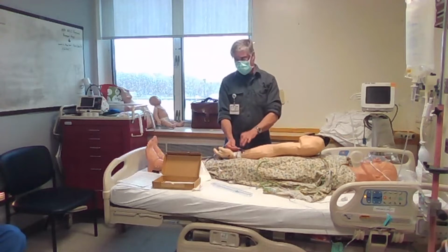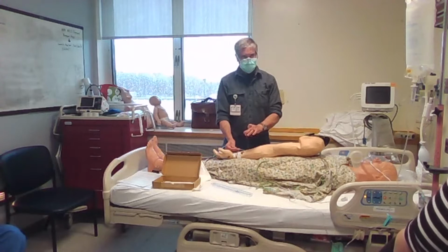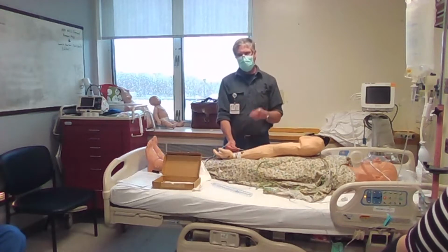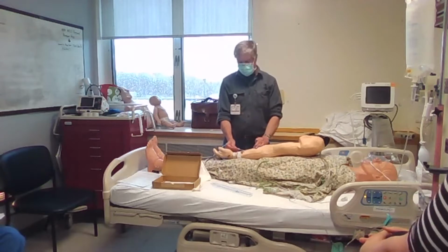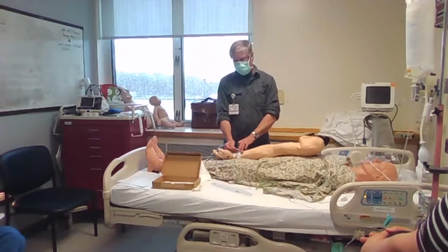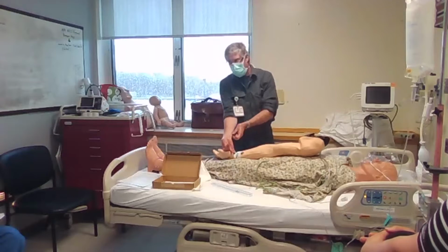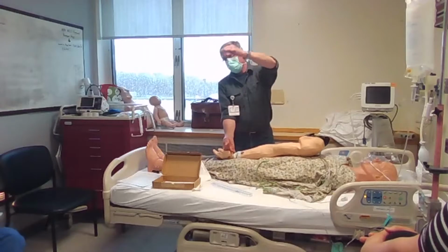You may not be able to use that site though. That's the only thing. I'm assuming arteries are the same as veins in that if you miss it, you have to go higher. Is that like the best practice? Not necessarily. If you actually get it and you get a flash, but you can't thread it or something like that, you could move more proximal, so towards the head. But you very quickly, and some people definitely run out of space there, where it becomes much deeper because the artery's diving at this point. Remember, you're finding it where it is coming up to go over the bones of the hand.